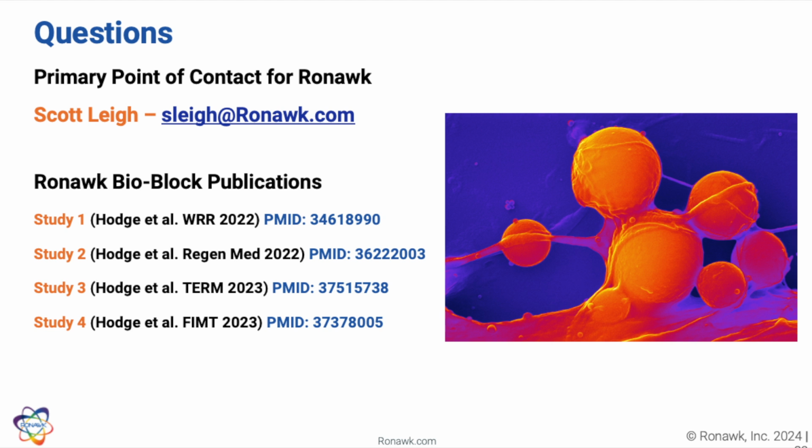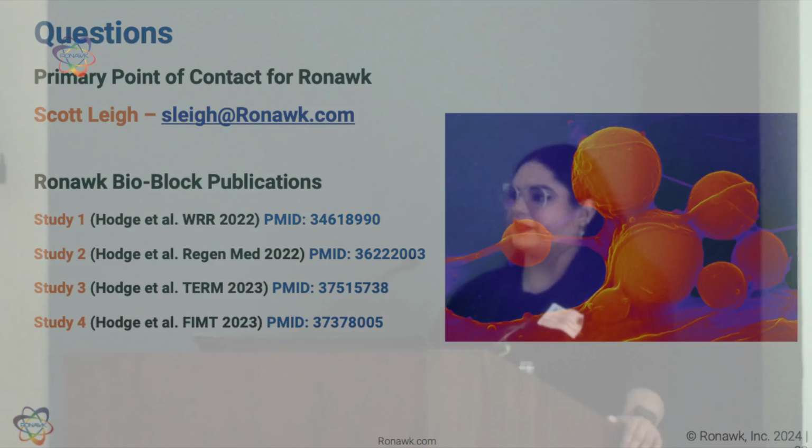I was curious how customizable these bioblocks are. So I think one thing that you mentioned is that you can modulate the rigidity of the Matrigel, but are there other features that you can change? So we can change the microstructure. So it doesn't have to be a puzzle piece shape.